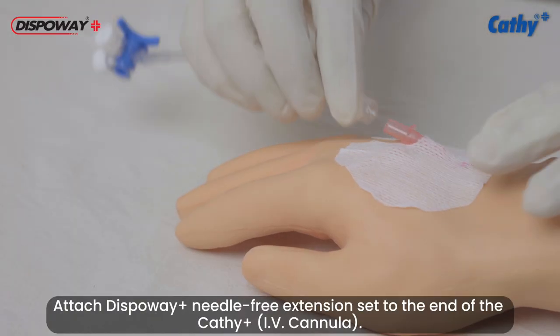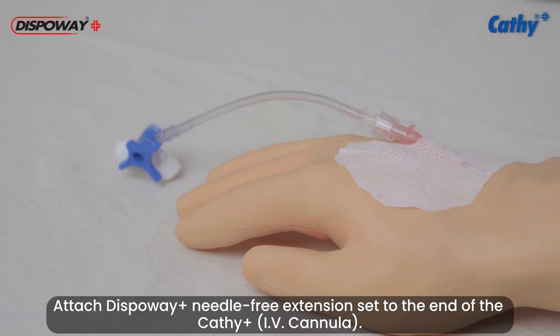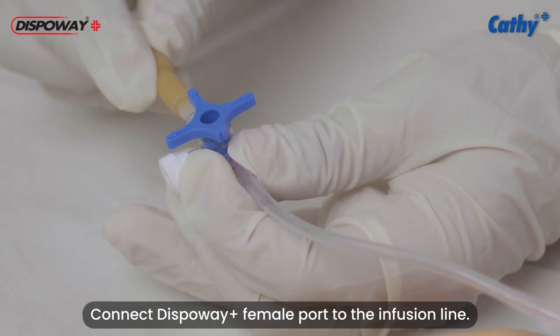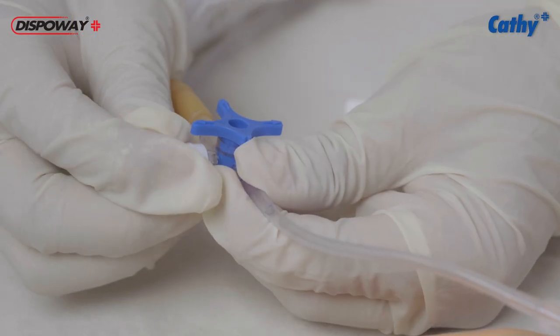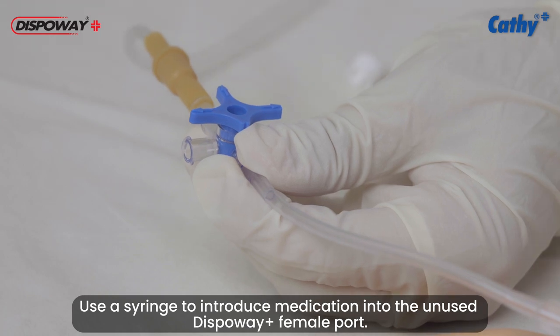Attach DispoVay Plus needle-free extension set to the end of the Cathy Plus IV cannula. Connect the DispoVay Plus female port to the infusion line. Use a syringe to introduce medication into the unused DispoVay Plus female port.